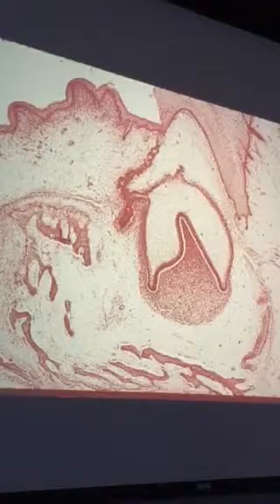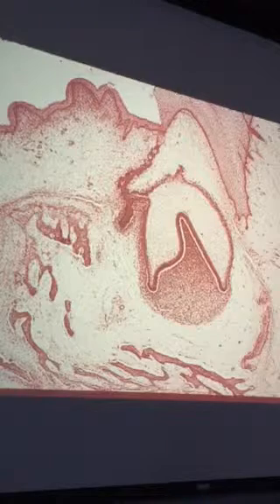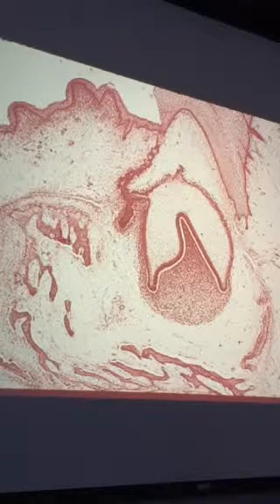Okay, and what is that thing right there? Permanent tooth bud. And there is the dental lamina. That would be fair game for the lab practical. Okay, and how about that cell, that cell, what are those? Fibroblasts. And just looking at this cell right there, and perhaps that one, where might you guess that this slide was taken? Pulp, right. Because we often have stellate fibroblasts within the pulp. Much like a mesenchyme.